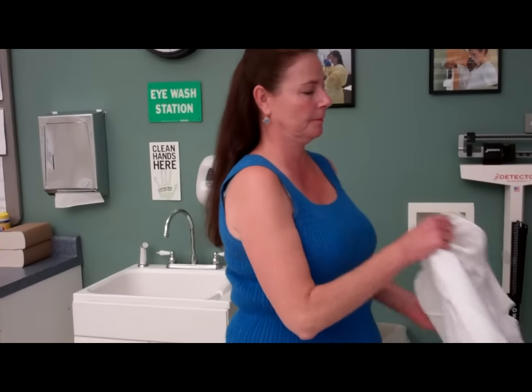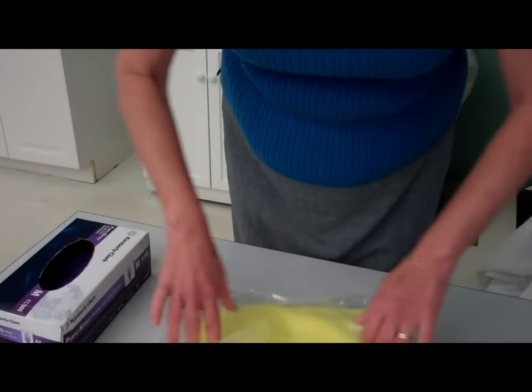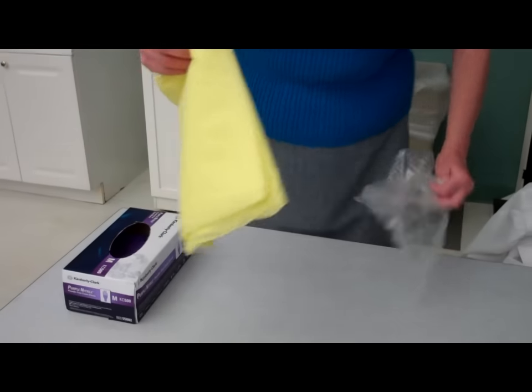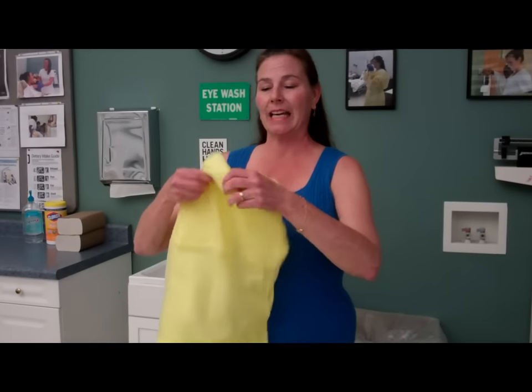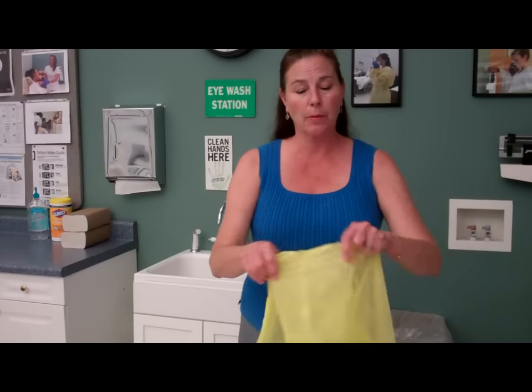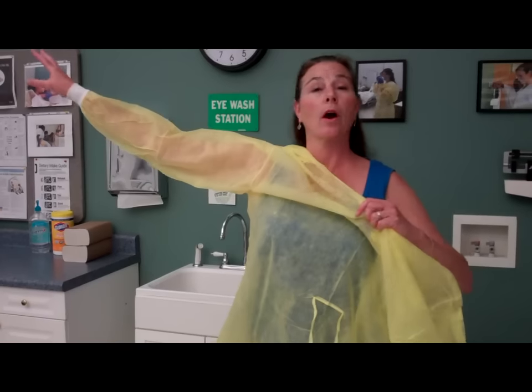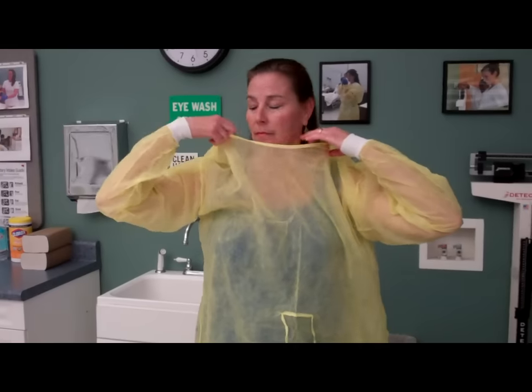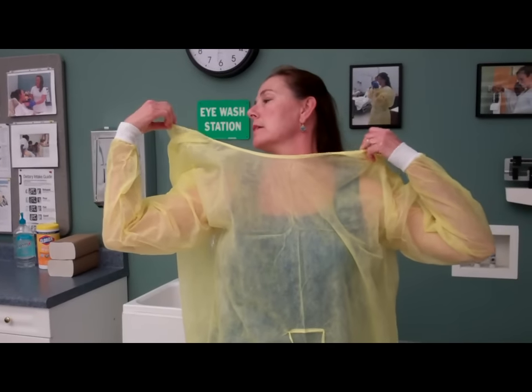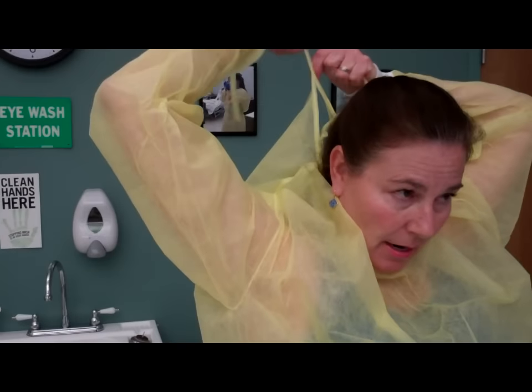I'll begin by removing my lab jacket. Open the package for the gown and dispose of that. Now, without flinging the gown in the air — because we must be wary of airborne pathogens — I'll place one arm in the gown, then the second arm in the gown. I'll then take the ties to the neck area and tie them.